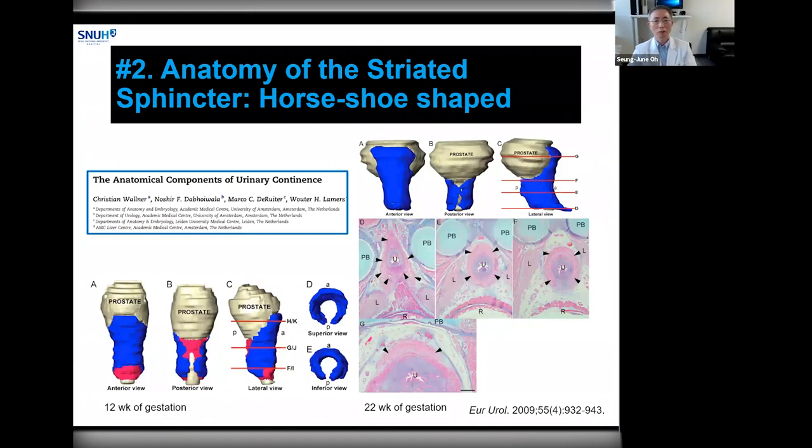Second, the urethral sphincter does not have the same shape in the anterior and posterior prostatic apex. Rather, it has a horseshoe shape, with the posterior side being thinned out and more sphincteric tissue in the anterior prostate. The anterior apical tissue forms a so-called anterior fibromuscular stroma with abundant elastic connective tissue. Therefore, the 12 o'clock side at the prostatic apical portion is the most important area in order to preserve continence.